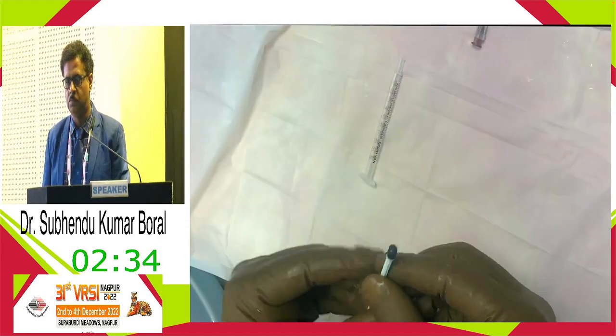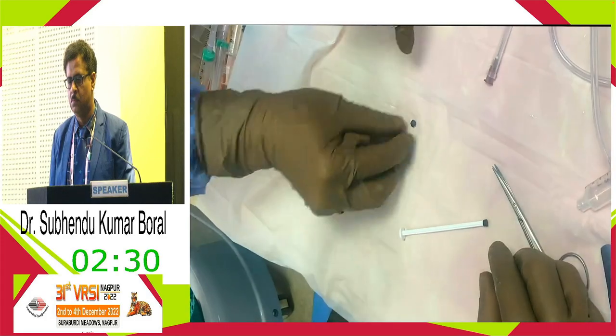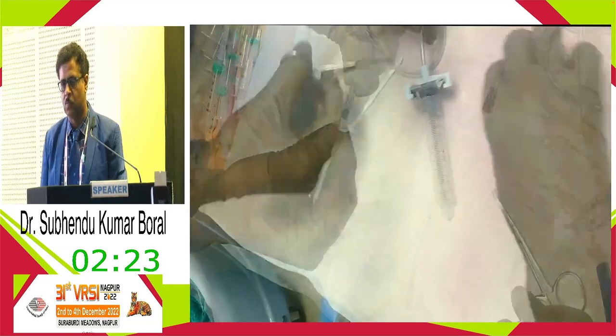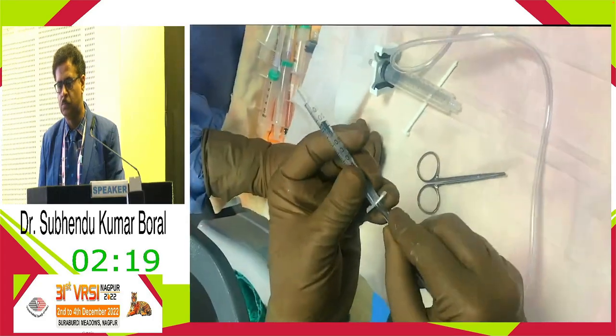We have removed the plunger and cut the rubber cap of the plunger of a 1 ml syringe. This cut rubber cap was fitted inside an empty 1 ml tuberculin syringe. Its end was fitted with the tubings of VFC of the vitrectomy machine.